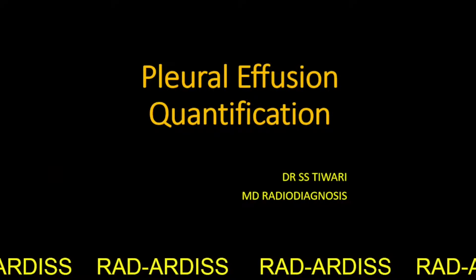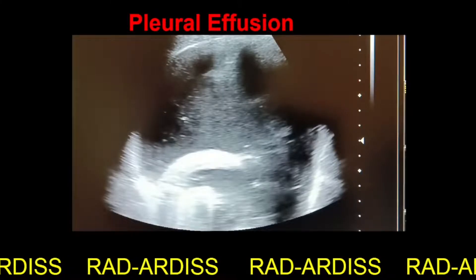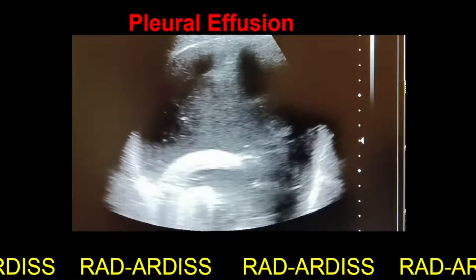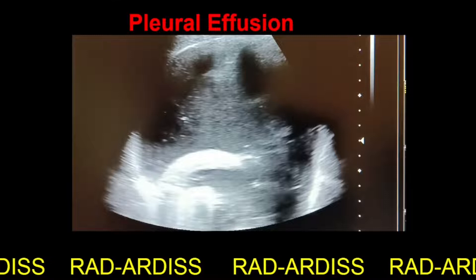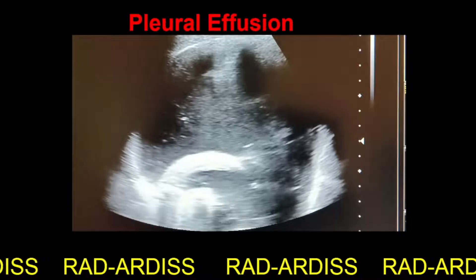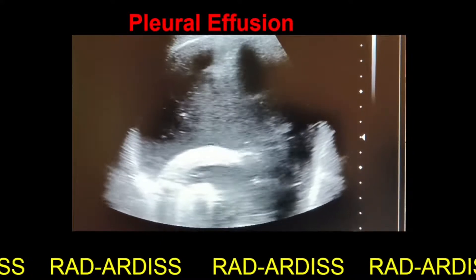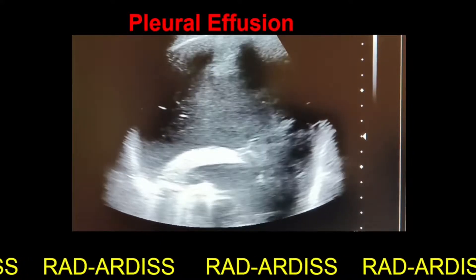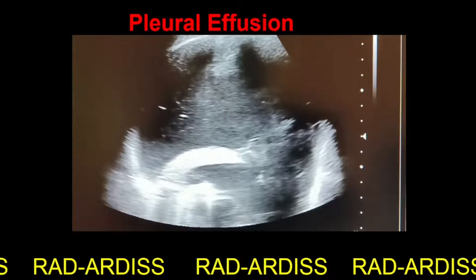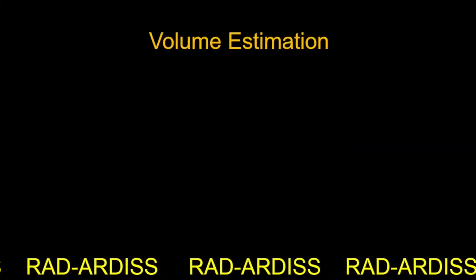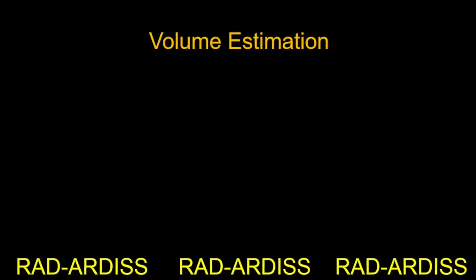This is the ultrasound image of the chest of a patient who is having pleural effusion. We can see that there are multiple floaters inside the fluid, which means this effusion is exudative effusion. Let us proceed towards volume estimation of this fluid.